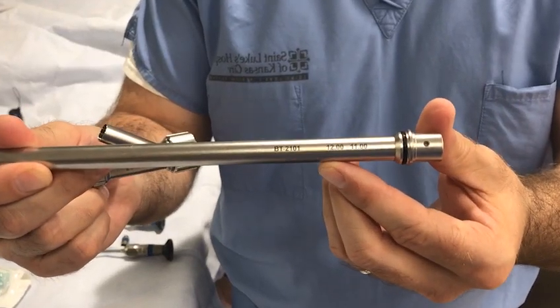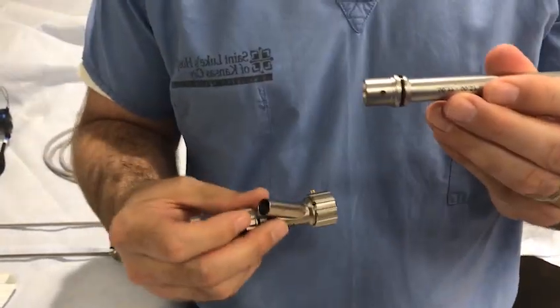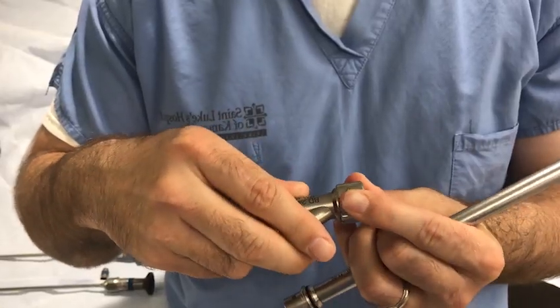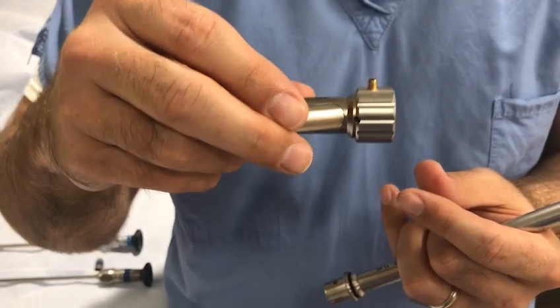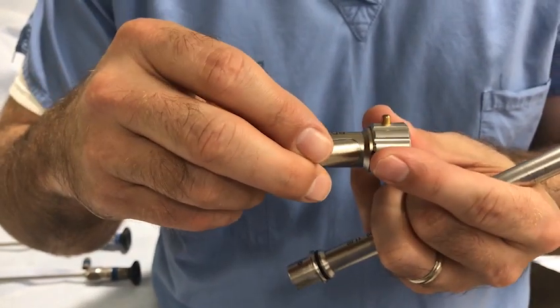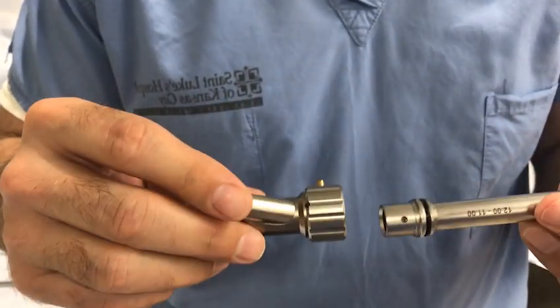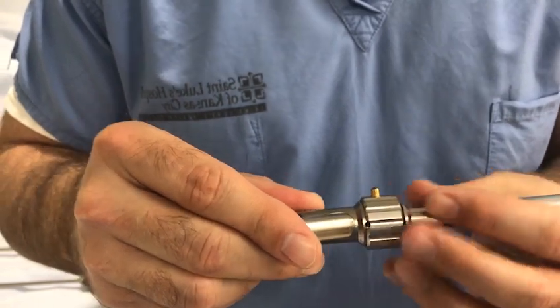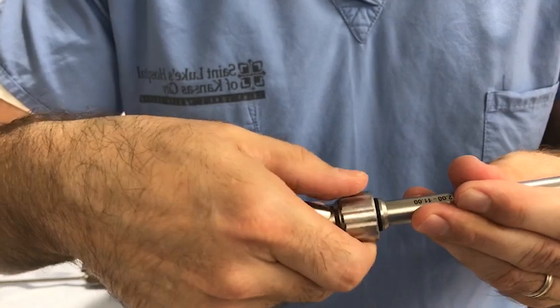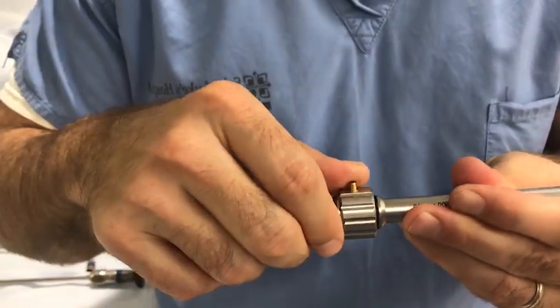The black 11-12 millimeter ventilating Bronchoscope barrel is chosen in this example. Expose the black dot on the distal end of the instrument barrel by rotating the locking mechanism. Align the black dots on the scope and instrument barrel and insert the scope until it clicks into place. Rotate the locking mechanism to secure the attachment. This step is important to prevent accidental dislodgement of the scope.